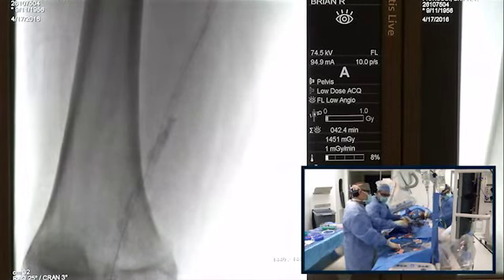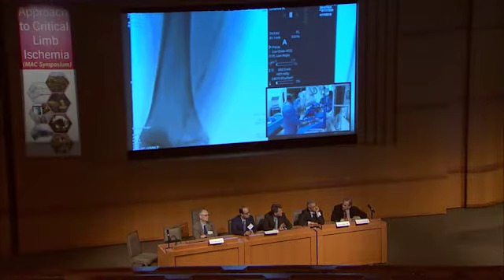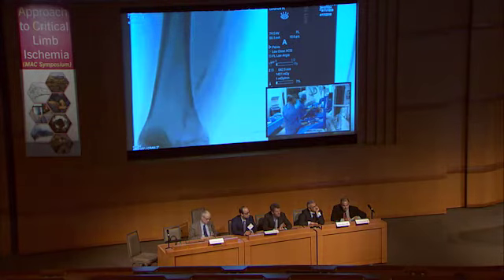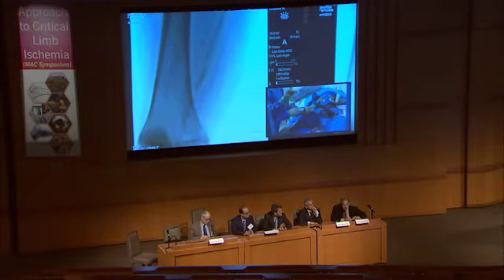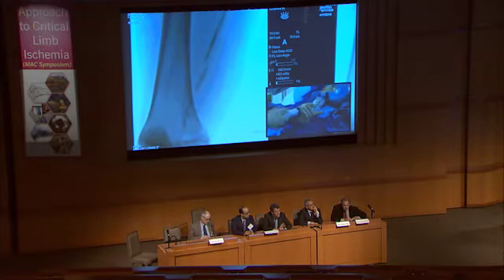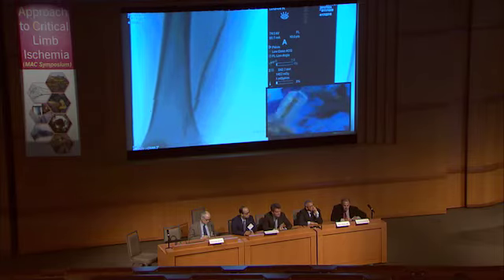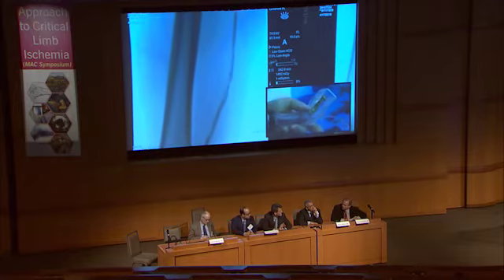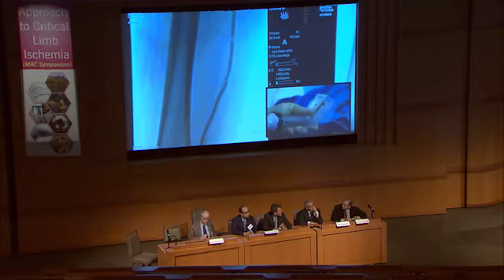Yeah, I think Supera has really opened up options in treating this kind of case that in the past was tough. Often we would put standard nitinol stents here and they would simply get crushed. That doesn't seem to happen if we can aggressively predilate. The big issue here is going to be, can he fully inflate this? And I think he's going to pay a lot of attention to pain, to see if he's causing pain as he goes up, because that's often a precursor to knowing if someone's going to go on to rupture. But even in this kind of dense calcium, it's been our experience that Supera routinely can open these with appropriate predilation. Haven't you guys seen the same phenomenon? Is this your go-to for this?